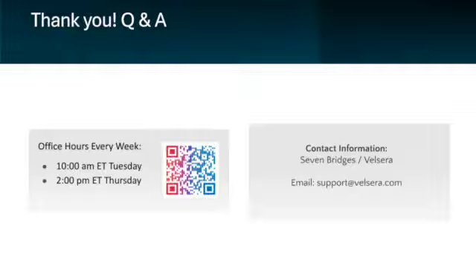Speaking of which, we also encourage you to explore the NCI's Imaging Data Commons, the IDC. This is a cloud-based hub of cancer imaging data. It's co-located with analysis tools like 3D Slicer, and it blends very well with the Cancer Genomics Cloud. IDC provides open, standardized access to diverse imaging data sets.